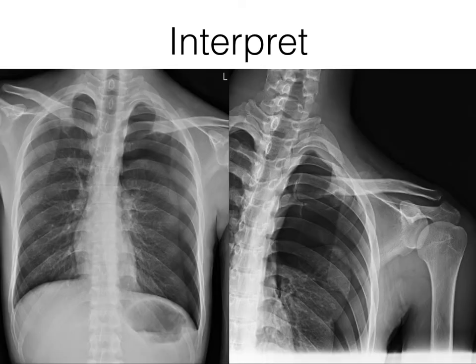Where we find this location depends on whether the patient needs a chest tube, drainage, or just observation. If you see the lung point only located in the anterior chest, that means the pneumothorax is minimal. But if you can only find the lung point outside the anterior axillary line, even to the posterior lateral side, that means the pneumothorax is quite large. You need to manage it immediately.